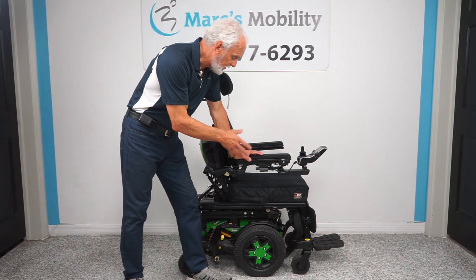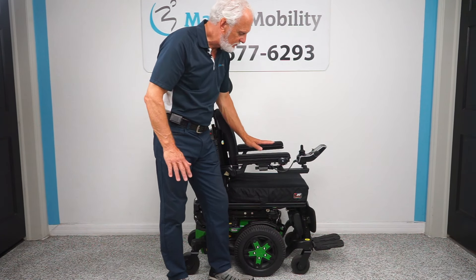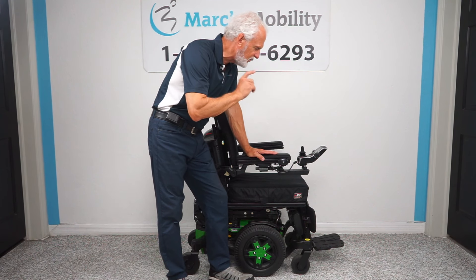All the functions on this chair have to be worked through the joystick. Take this button on the left side to turn the power on and keep going forward until you see a picture of your seat on the screen. Now I see a picture of the seat on the screen. I want just the bottom cushion to be yellow — that's the seat lift — and that's the first thing I want to show you.